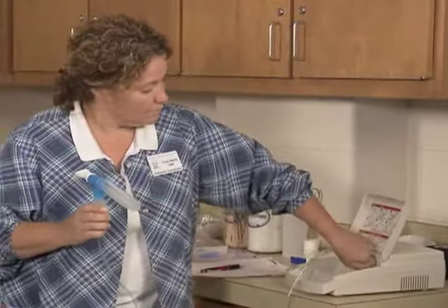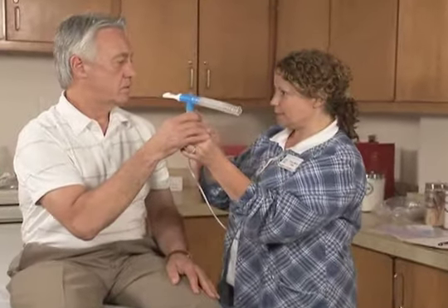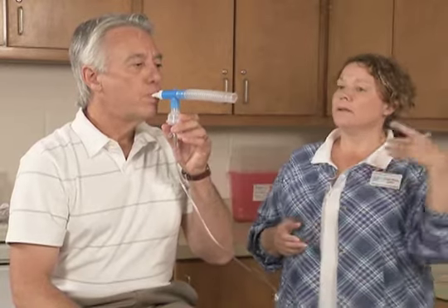on the nebulizer machine. Ask the patient to put the mouthpiece in their mouth and make a seal with their lips without biting the mouthpiece. Instruct the patient to breathe normally during the treatment, occasionally taking a deep breath. An occasional deep breath will help deep lung tissue absorb the medication.